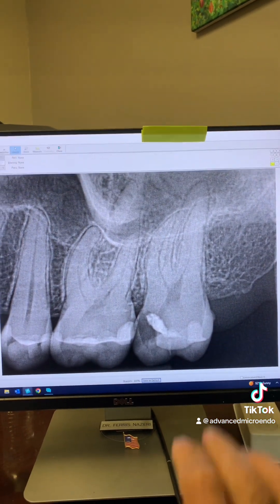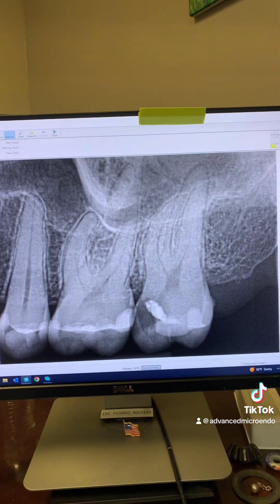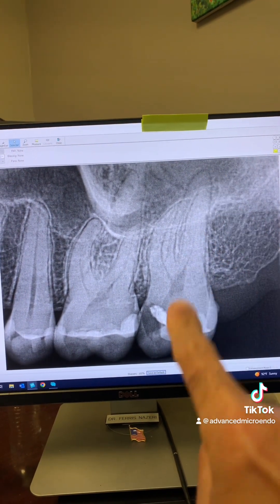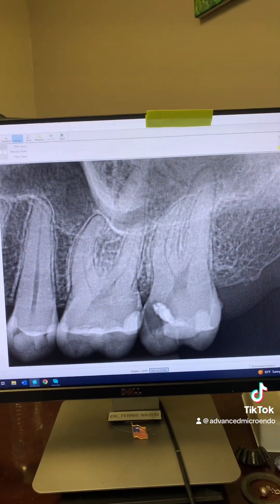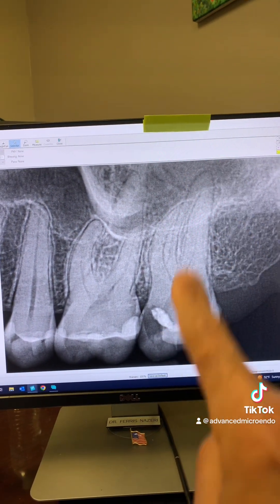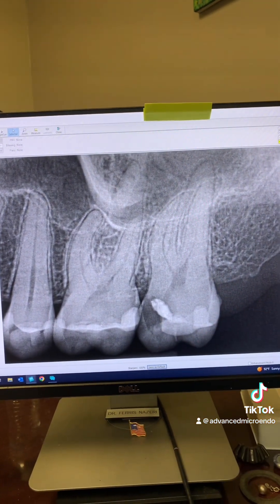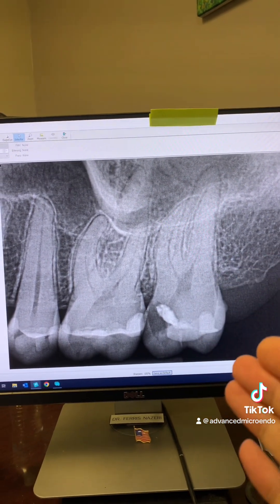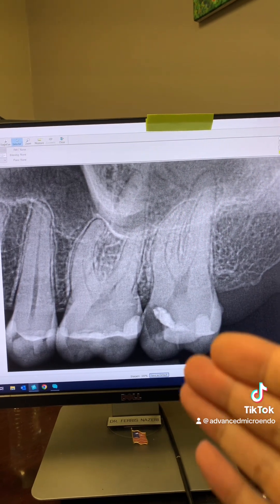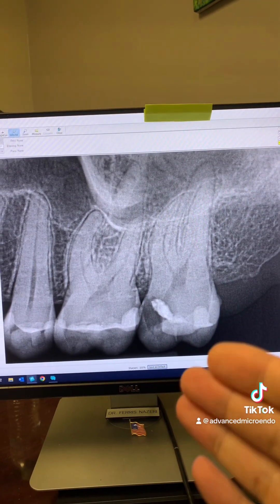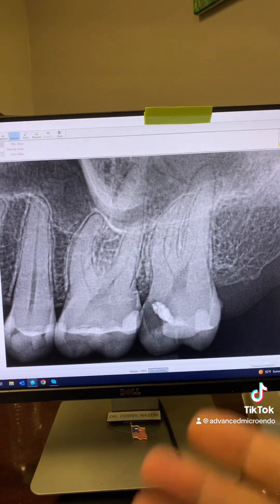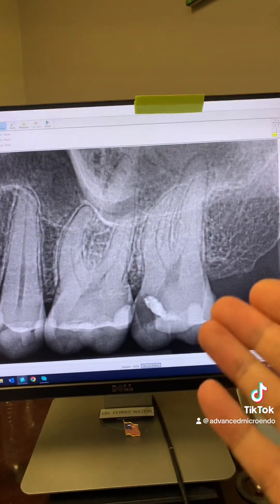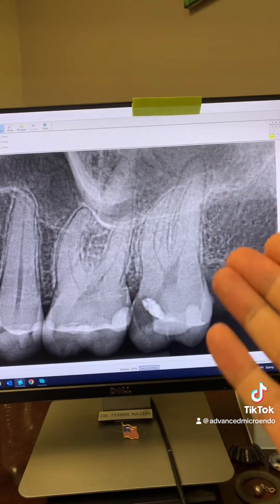So it was really, really tough for her and for us to do a root canal on tooth number 15. These were 21-millimeter long roots, and looking at the radiograph here, you really can't tell if this tooth has whatever canals you think it should have — three canals, four canals, five canals, six canals. And you also can't see the curvature of the canals, how curved these canals are.